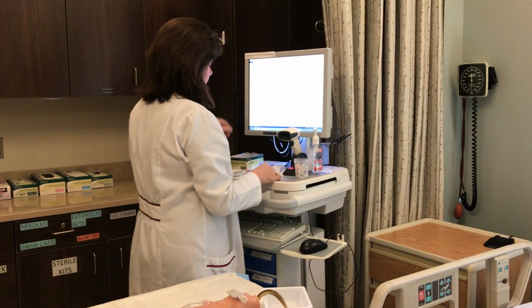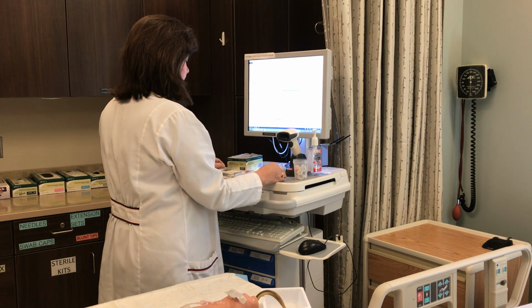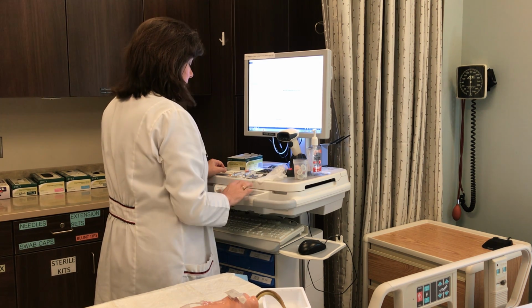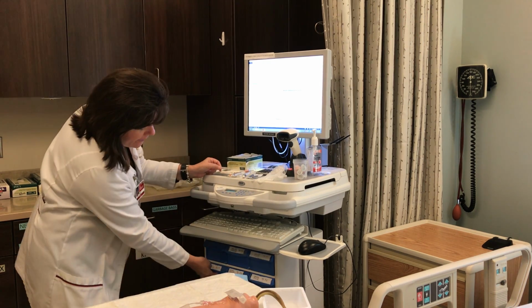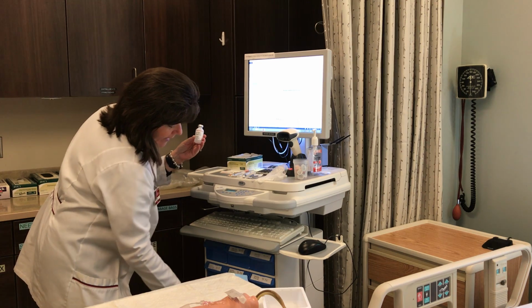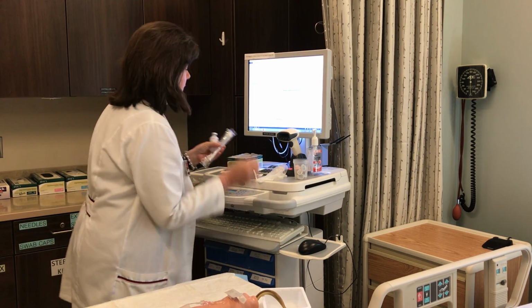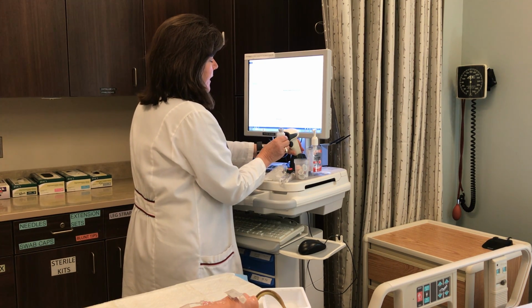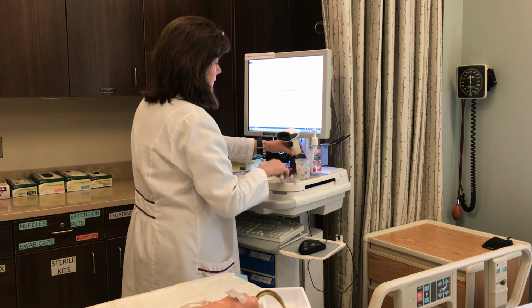Select and scan correct medication vial and normal saline flush syringes. Verbally verify the 5 rights of medication administration on vial and syringes. First check. To access my medication, I put in the code 1234 and the drawer will pop open. I gather my medication and also 2 saline flush syringes. I'll begin my first check by scanning my medication and scanning my saline flushes.